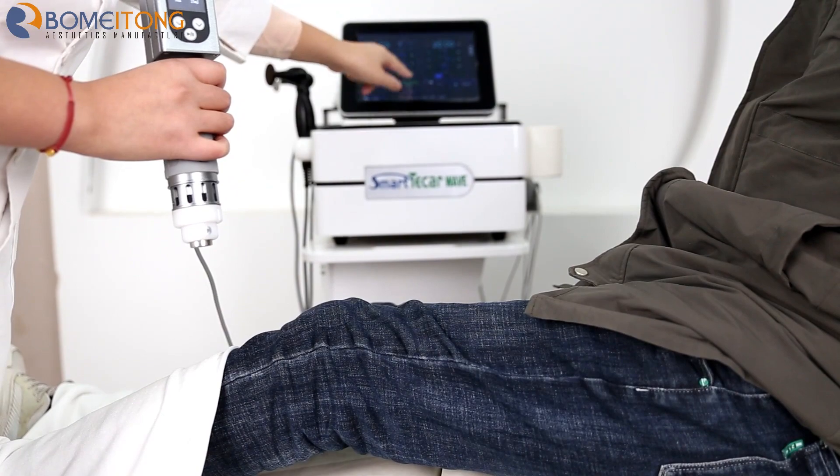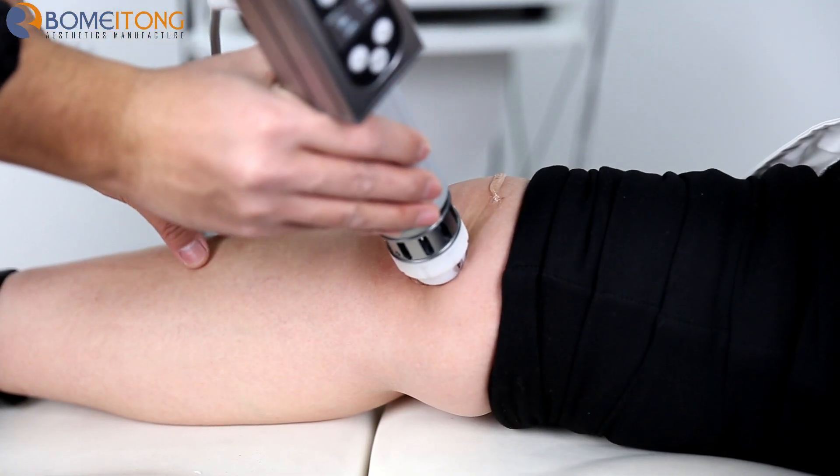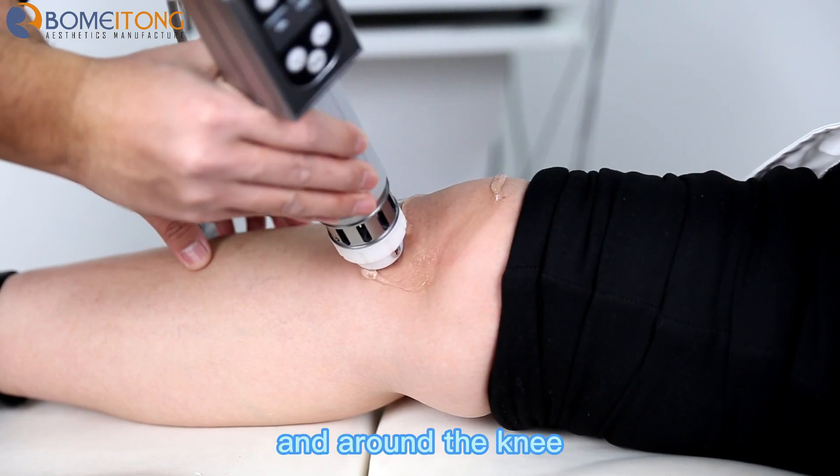Click start and click the button, then start the treatment around the knee.